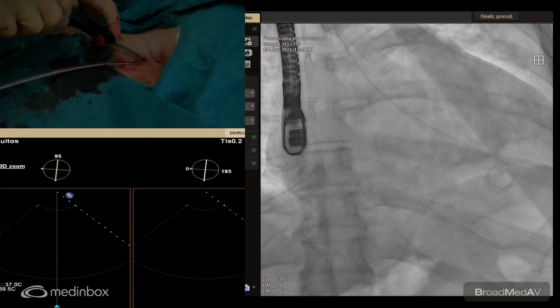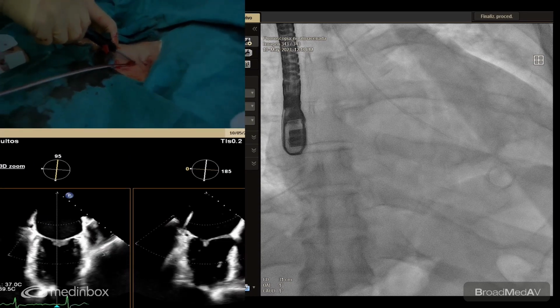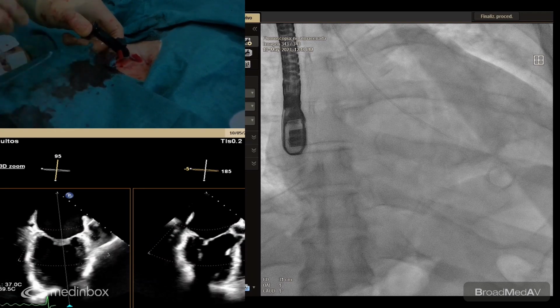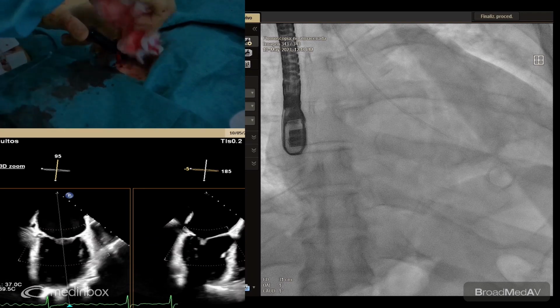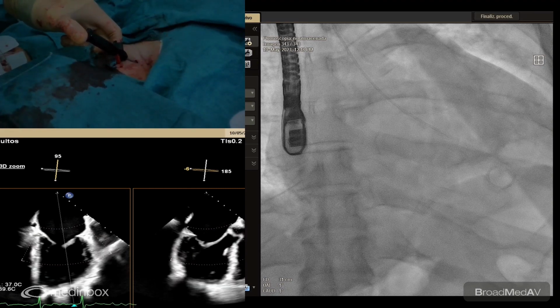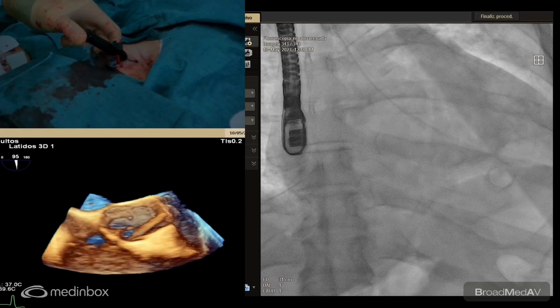No, it's better without light for the. Bueno, okay, muy bien. Voy a volver a... It's very easy to take. Sí, bueno. Yes, no problem. Okay, stretching. Like previous.